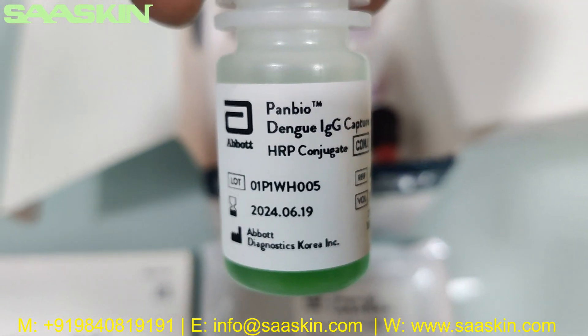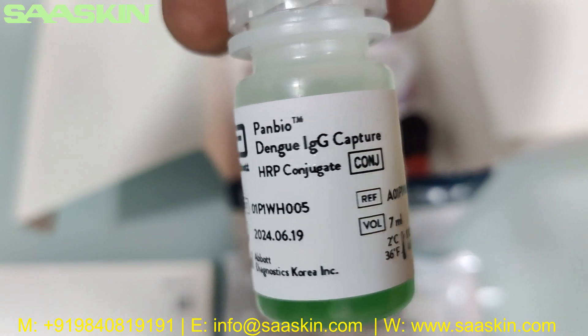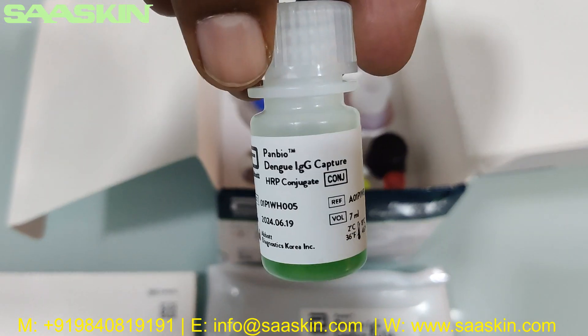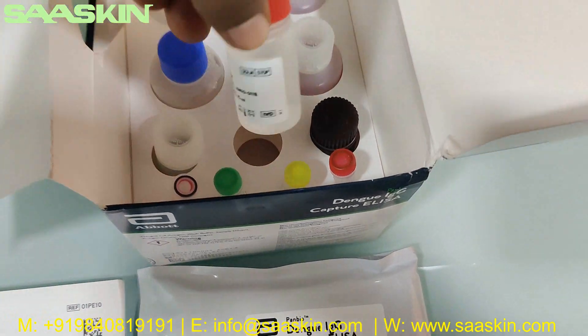Here you can see it is the Panbio Dengue IgG Capture HRP conjugate, and you can see it is a 7 ml bottle. That is the HRP conjugate.